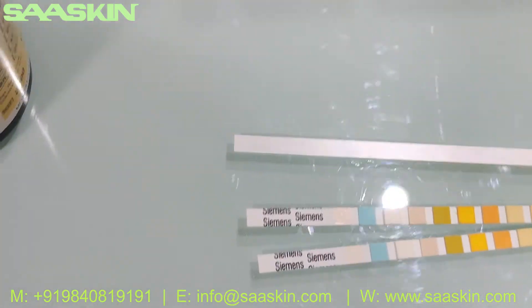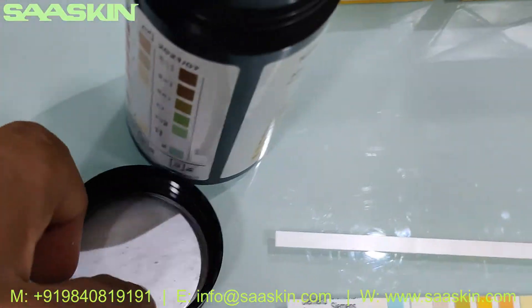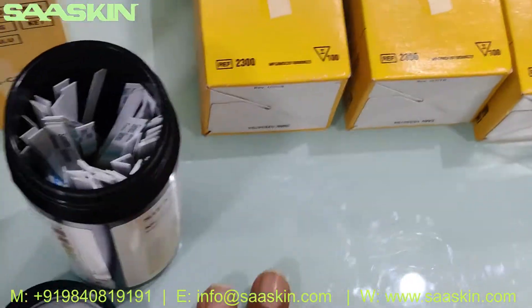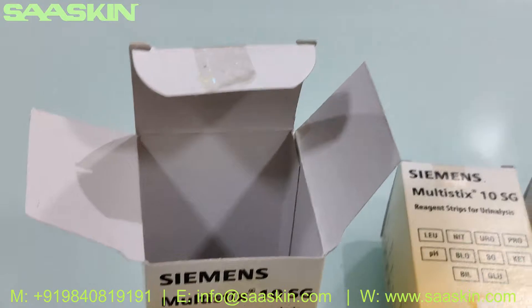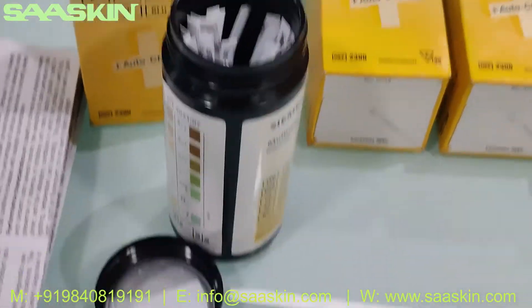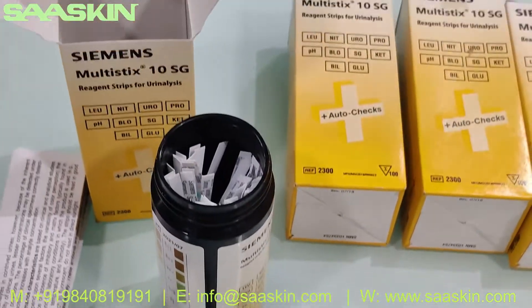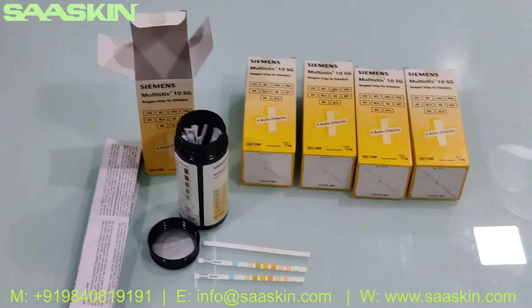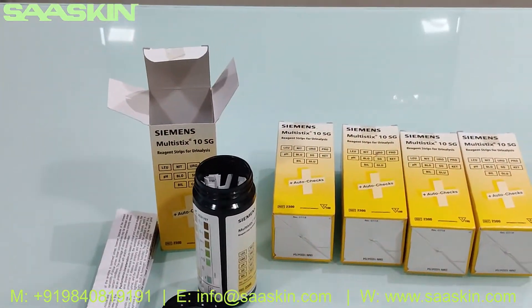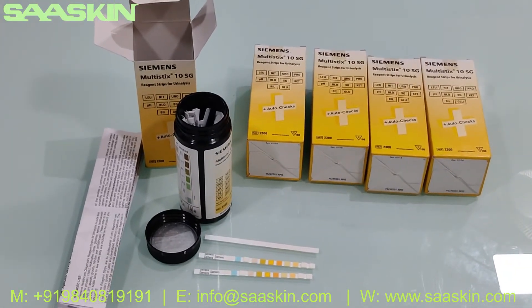This is how the strips look like in a plastic container, which contains all 100 test strips. Basically, my intention with this unboxing is to show you what is contained in the box — each box contains a manual and a plastic container that has the 100 strips. This is the complete introduction about the Siemens Multistix 10SG urine analysis strip. Thank you.